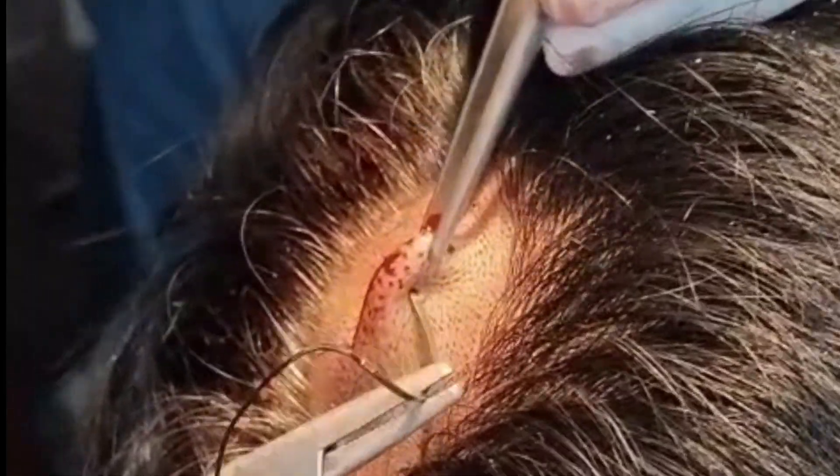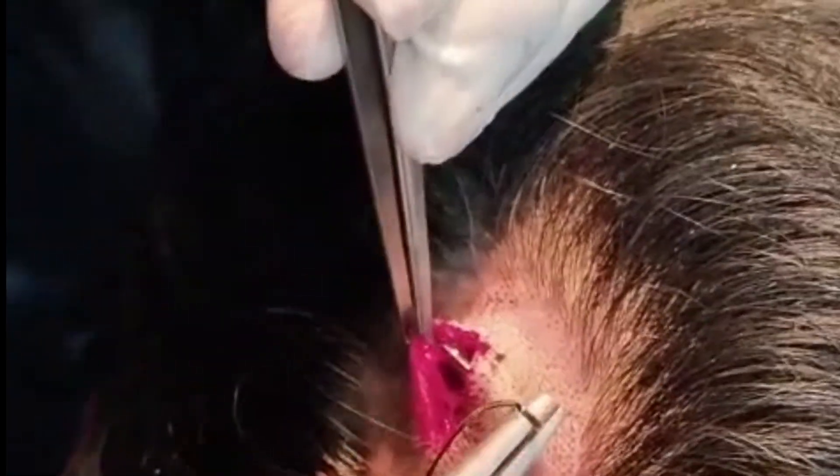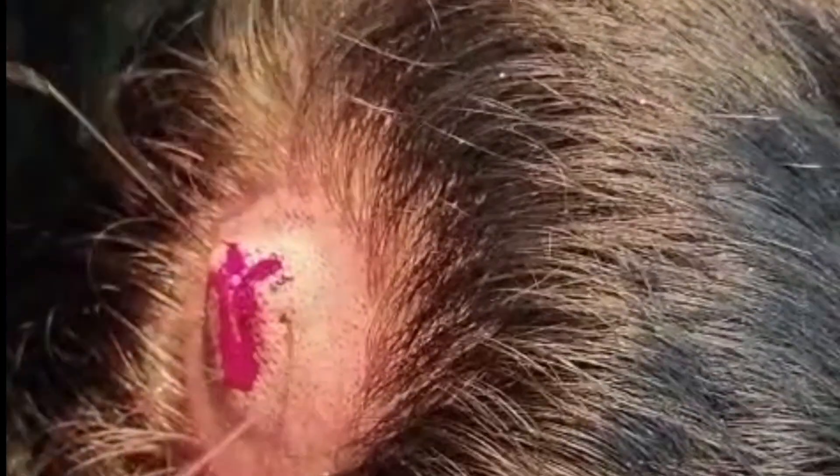I used suture to close the incision site carefully, ensuring proper wound approximation and promoting optimal healing. I then used a sterile sponge to gently clean the wound and applied a proper dressing.